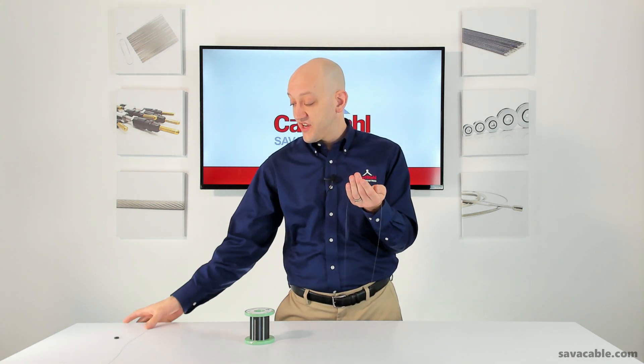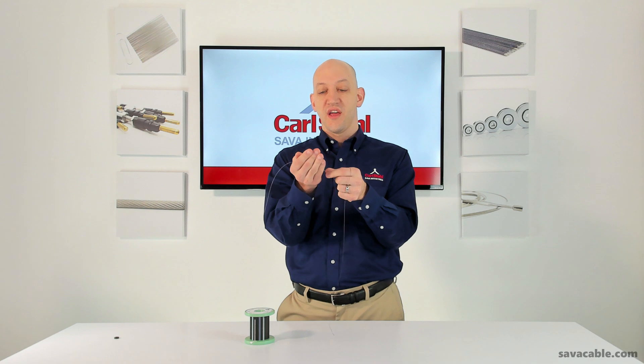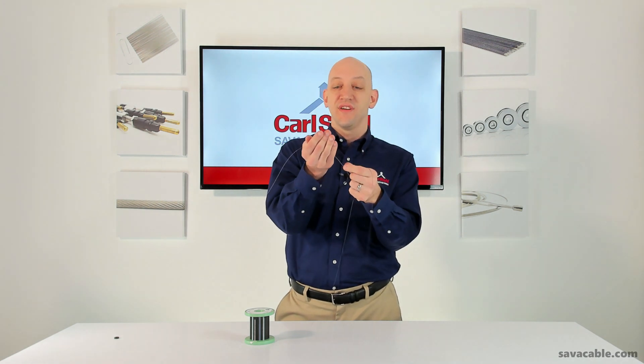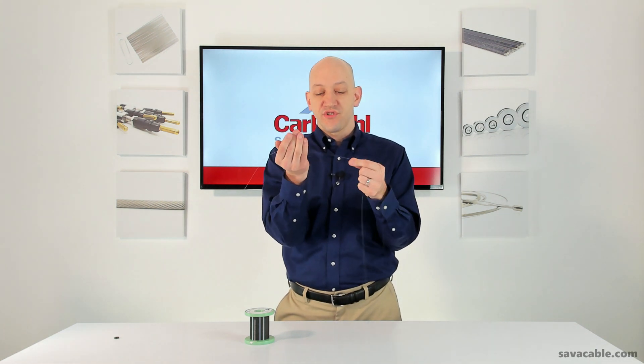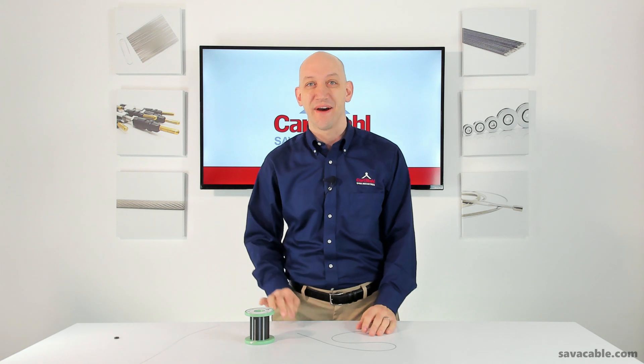A similar cable in stainless steel — not quite the same wire construction, but you can clearly see the difference here. It won't even stay in my hand. It just wants to show its rigidity. There's a friction to it. It definitely doesn't just fall right off my hand like the tungsten one did.